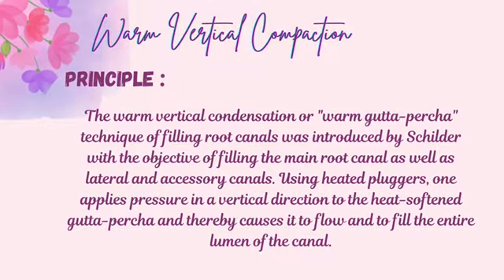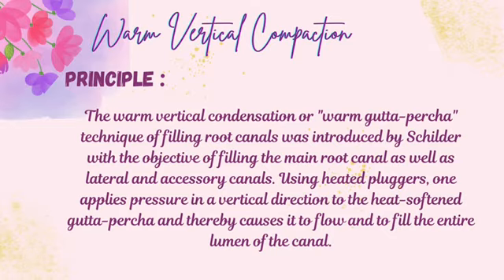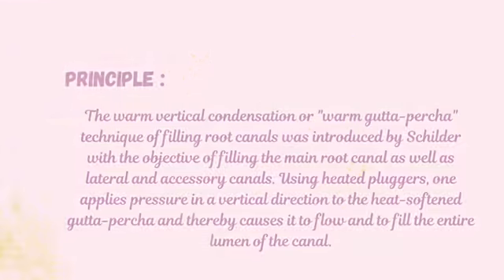Next we go to warm vertical compaction. The principle: the warm vertical condensation or warm gutta percha technique of filling the root canals was introduced by Schilder with the objective of filling the main root canal as well as the lateral and accessory canals. Using a heated plugger, one applies pressure in a vertical direction to the heat-softened gutta percha and thereby causes it to flow and to fill the entire lumen of the canal.